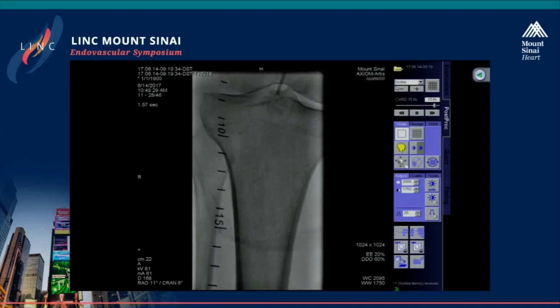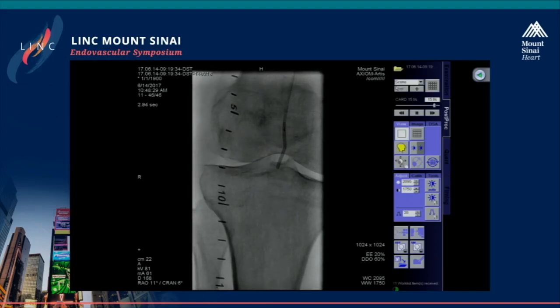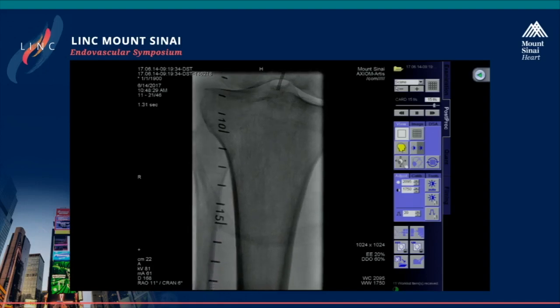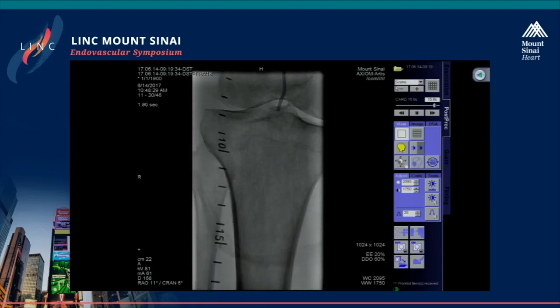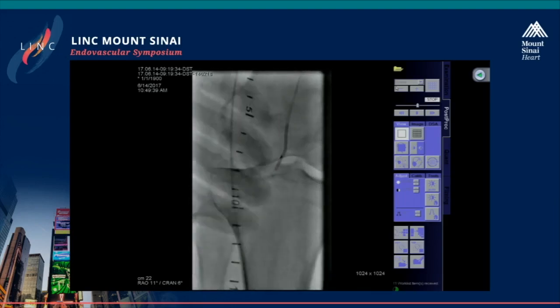Which will be the first guide wire that you intend to use? The Terumo M wire, because in our algorithm, since we don't have severe calcium here, we tend to go with a more hydrophilic wire to try to find the plane. Is it antegrade access you have? Maybe one of your partners can tell us while you're trying to wire. Is that antegrade access you have in the right, or contralateral? Up and over, contralateral.